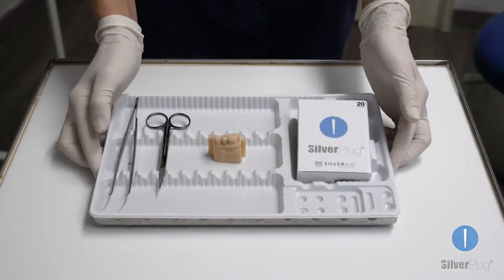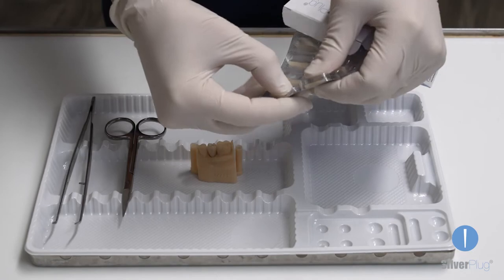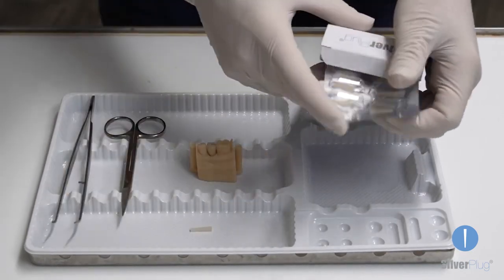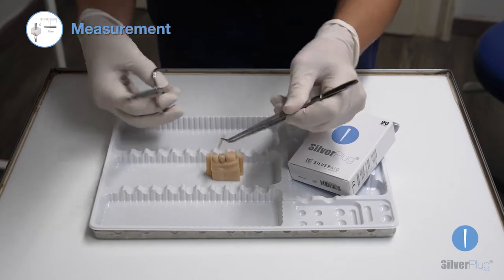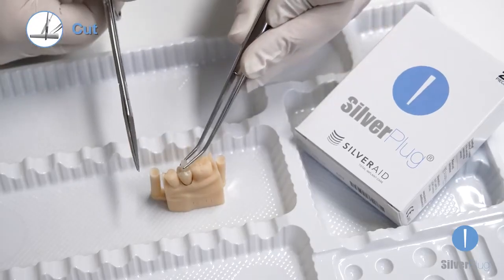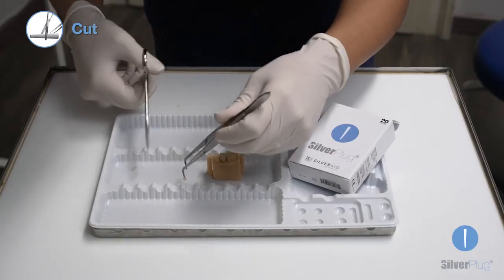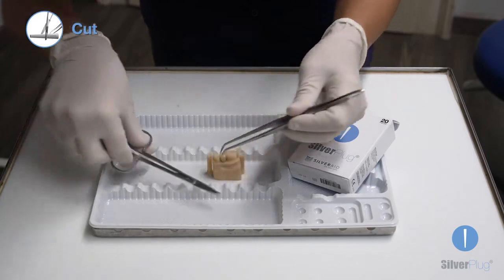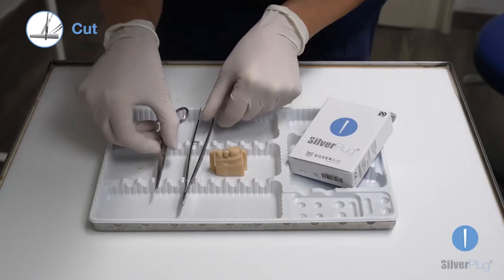The tapered shape of SilverPlug enables the correct fitting to any abutment access canal depth and diameter. It is possible to directly verify the depth of the screw tunnel and assess its maximum diameter. As an alternative, the use of a gradiated periodontal probe is recommended. Cut the correct section of a SilverPlug in order for it to fill the access canal and to be totally adherent to the sidewall of the tunnel in its larger section.